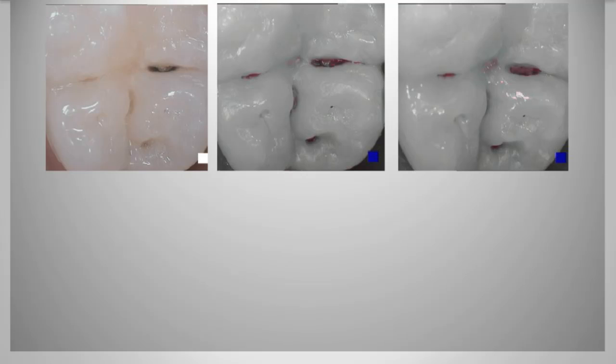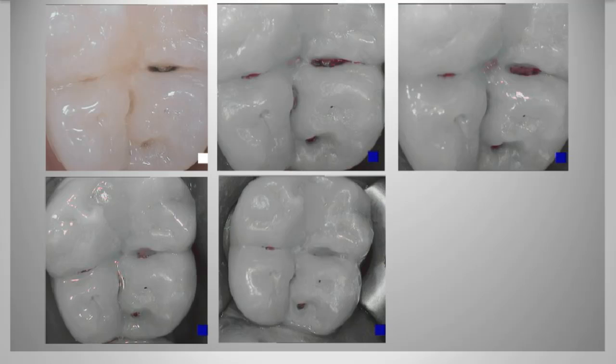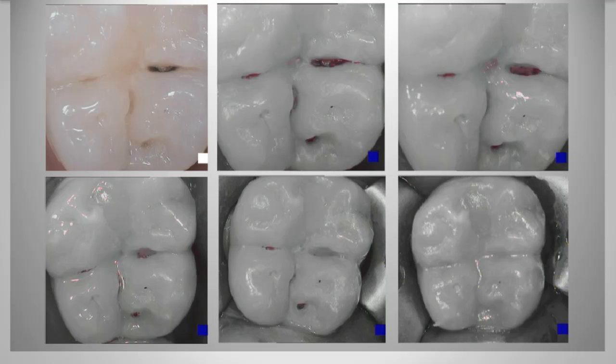So the doctor starts to prep, and you can see the prep is starting a little bit here, and they're starting to shape up and prep these areas. When he's prepping, he can be as minimally invasive as possible, because he can use the camera to actually view and see when the decay is eradicated. This is the next step, and then of course the remaining red was taken out, and then this beautiful composite restoration.